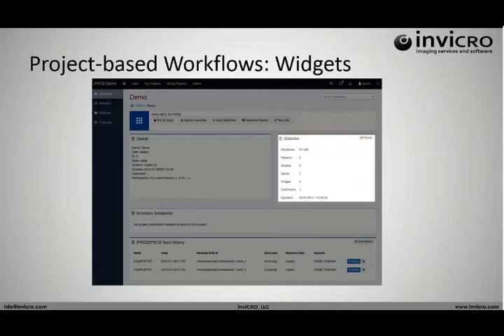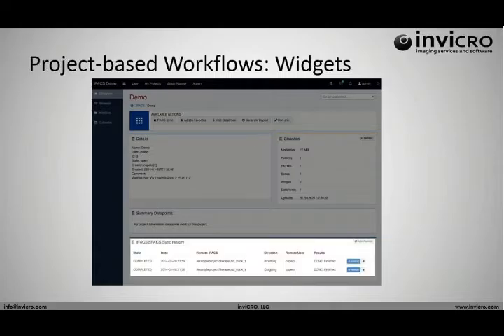You want to see notes from collaborators or team members, and a history of jobs that may be run on that project, and various things. So we've added some of these as a first pass, but we're looking, first internally but a lot externally, at how to develop this page to really be a landing spot for a project.